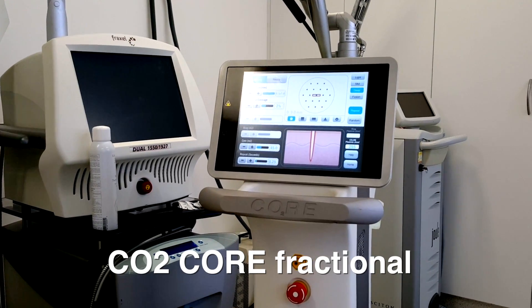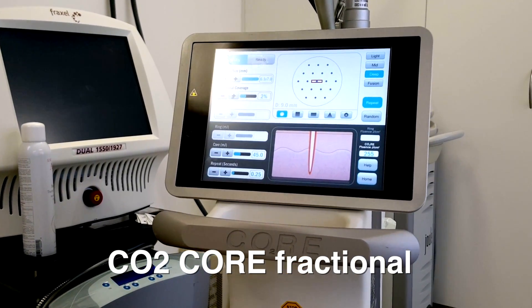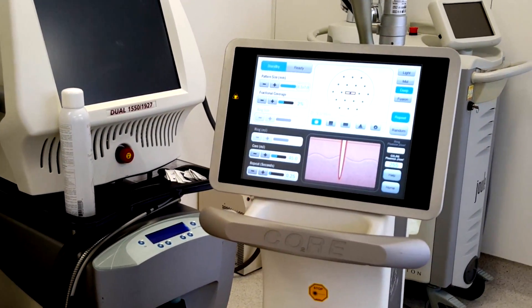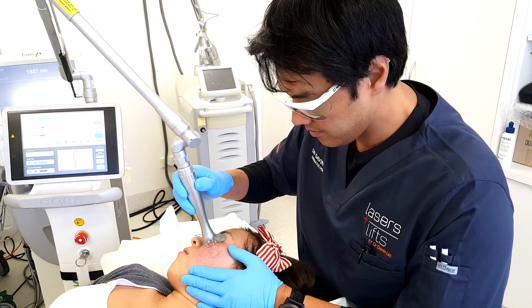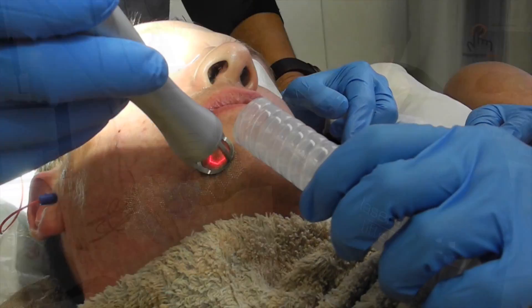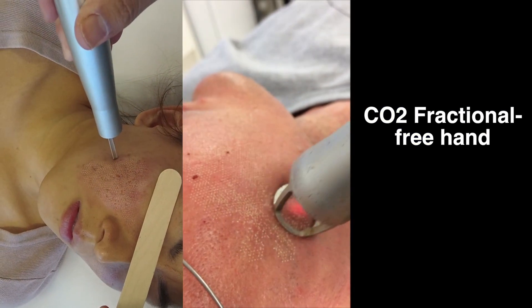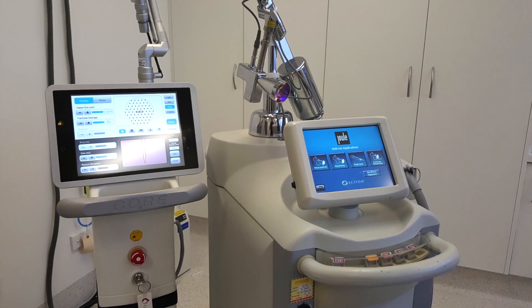Another fractional laser which I like using is the CO2 Core by Syneron Candela. The reason why I like using this laser is the flexibility of use. I can freehand and control the density itself, and I can do multiple overlaps from 1% to 5% and keep overlapping on certain spots. I find this a much, much more versatile laser, and this is the laser of choice for acne scar revision — that's when I'm using it to treat rolling and atrophic scars.